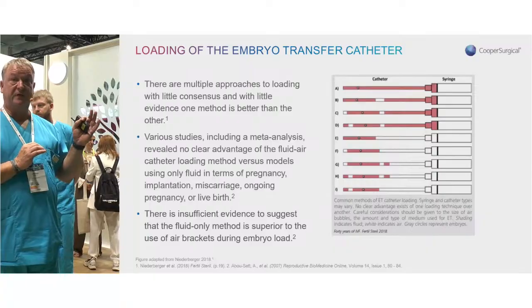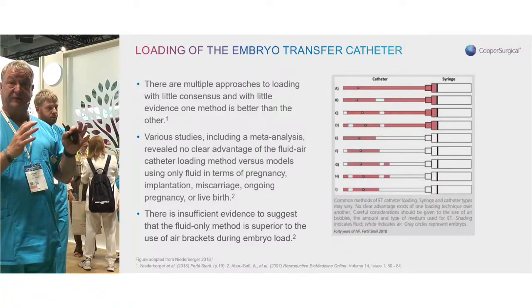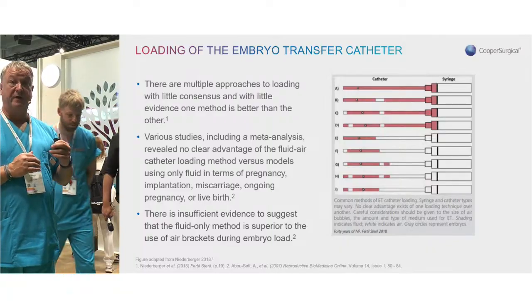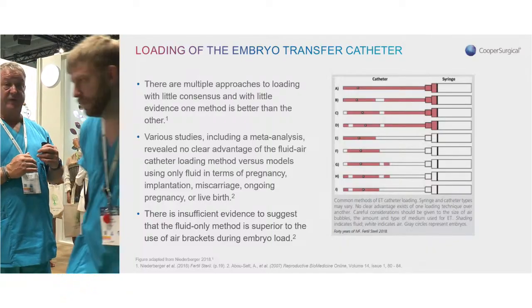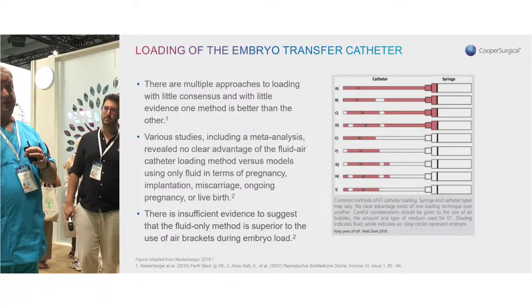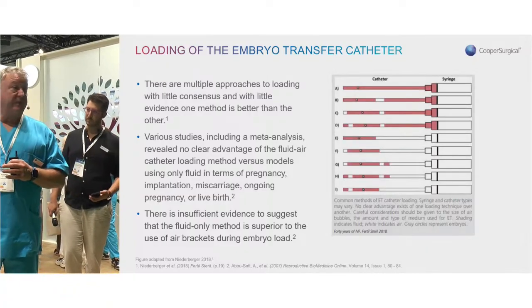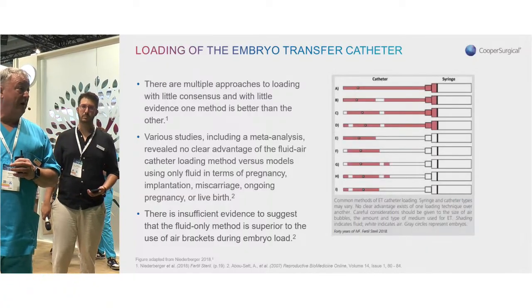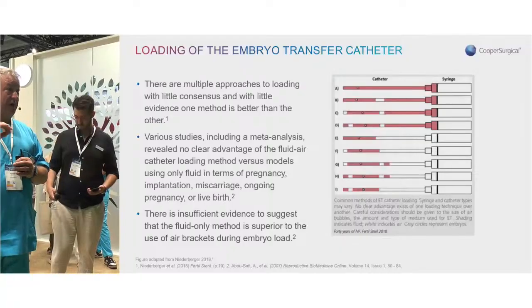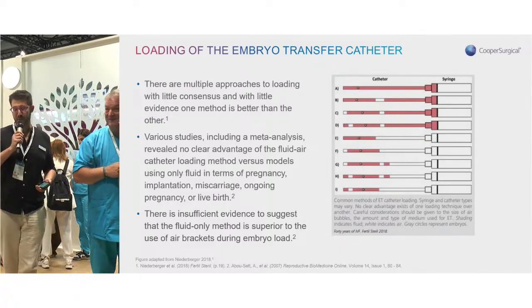I'm just going to pass over to Joaquin briefly, and he's going to demonstrate just how we set the system up with a little bit of new innovation that we brought in this year. So Joaquin will just explain the witnessing process to you, and then we'll load the catheter. Once we've loaded the catheter, I'll demonstrate how the simulator that we have works in helping to train on embryo transfer. Okay, Joaquin? Thank you, Steve.